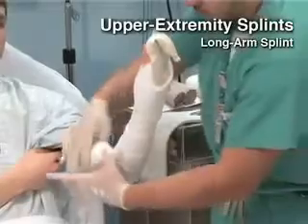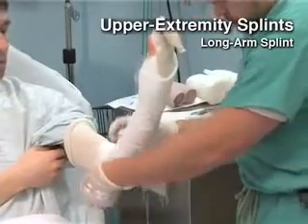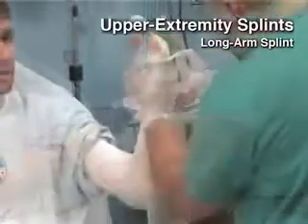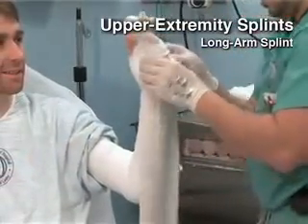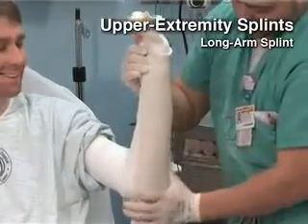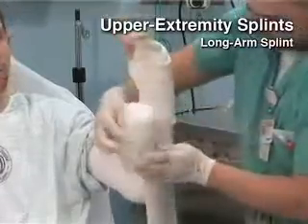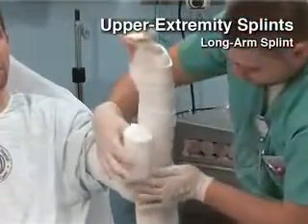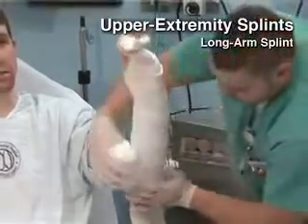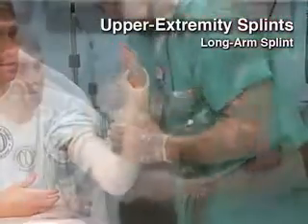A long arm splint will immobilize proximal forearm and elbow fractures. It can also provide temporary stabilization of intra-articular fractures of the distal humerus and olecranon while awaiting surgical care. When splinting a joint at an angle, be sure to wrap the extremity in the expected final position. Avoid excessive padding around the anterior aspect of the elbow joint in long arm splints, as this can result in skin pressure points and swelling under the splint.